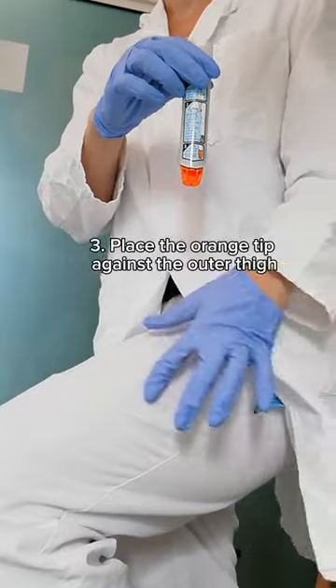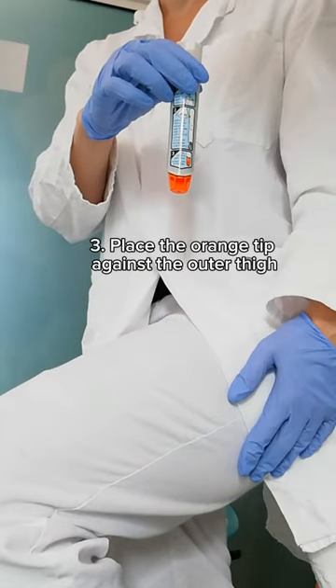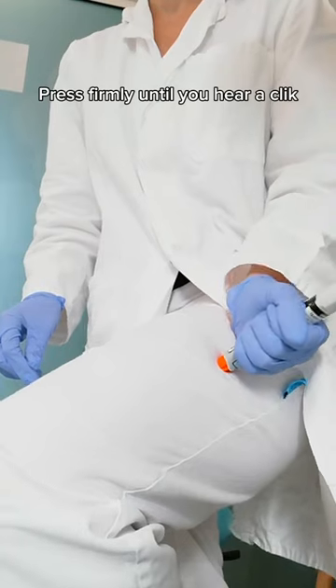Step 3: Place the orange tip against the middle of the outer thigh, and firmly push it against your thigh until it clicks.